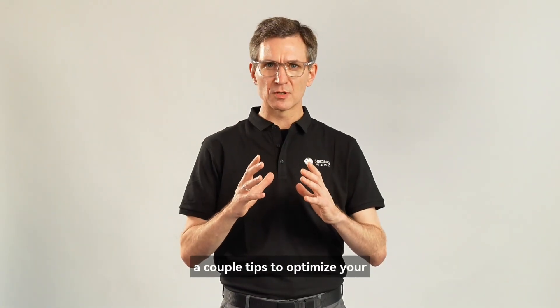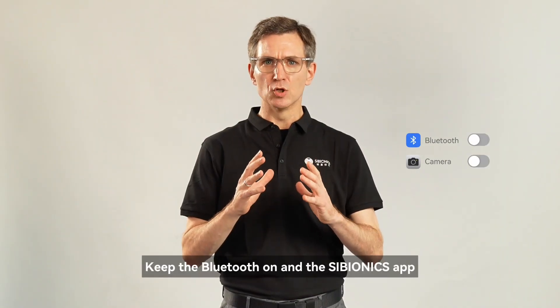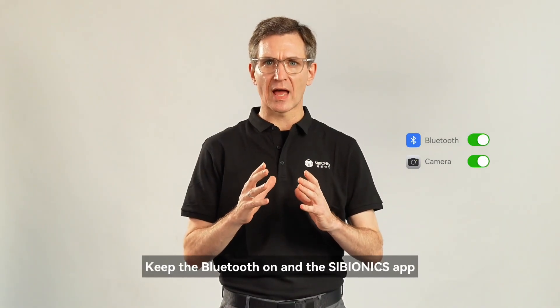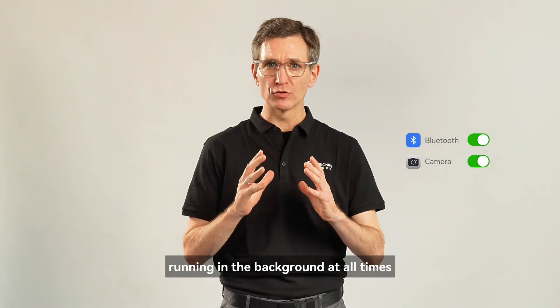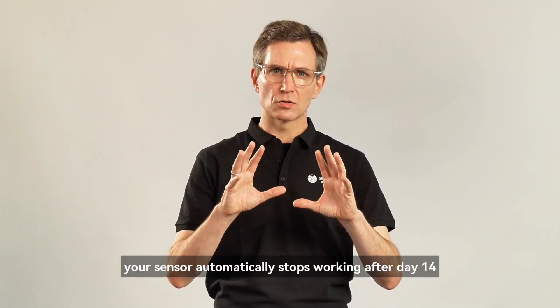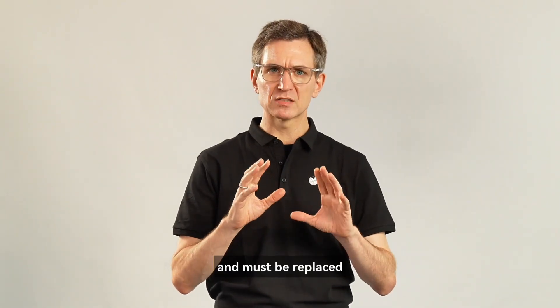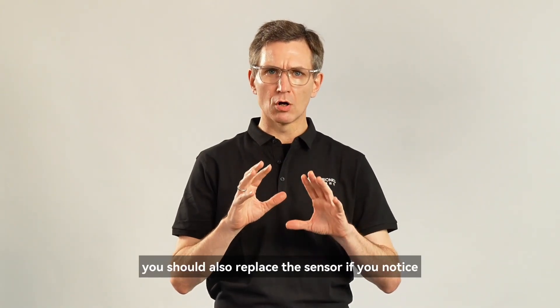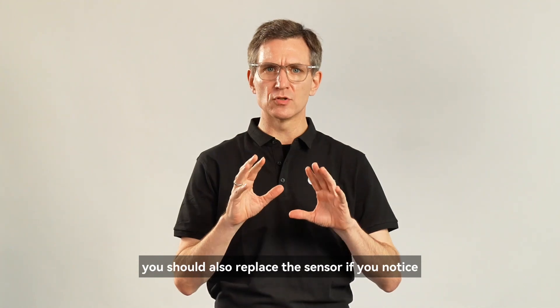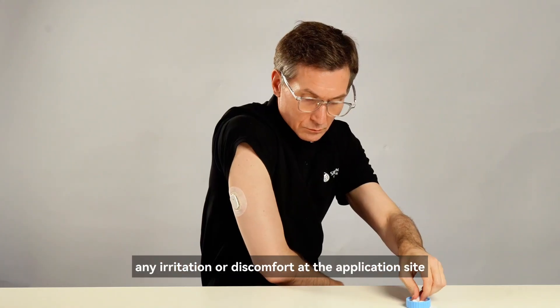A couple tips to optimize your SIBIONICS user experience. Keep the Bluetooth on and the SIBIONICS app running in the background at all times to ensure you'll never miss any data. Your sensor automatically stops working after day 14 and must be replaced. You should also replace the sensor if you notice any irritation or discomfort at the application site.